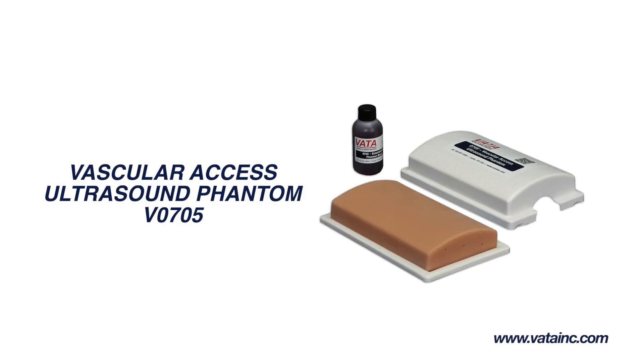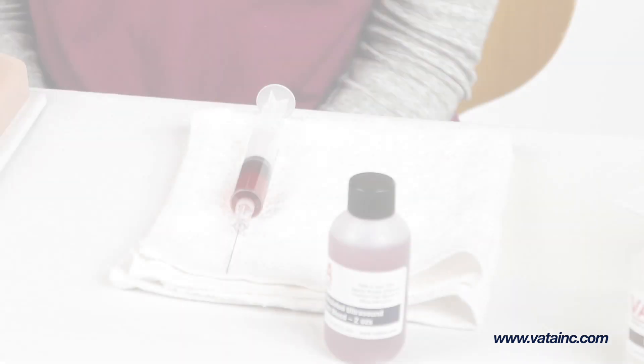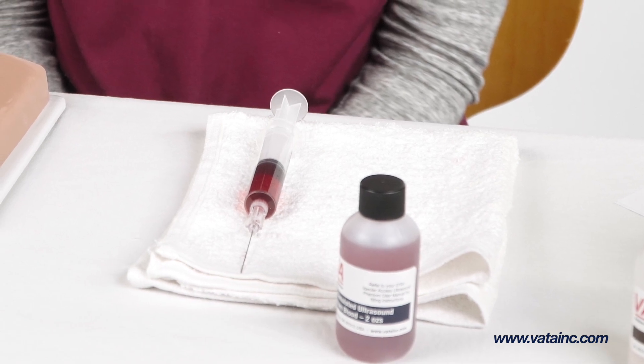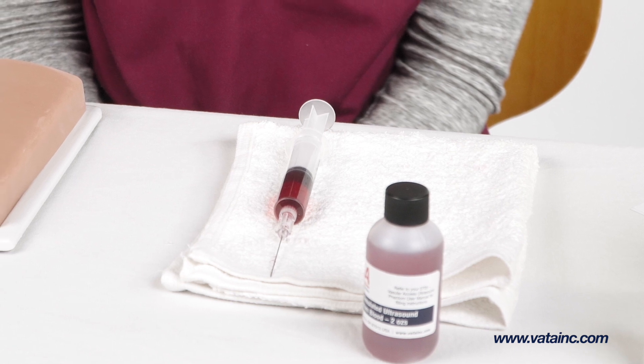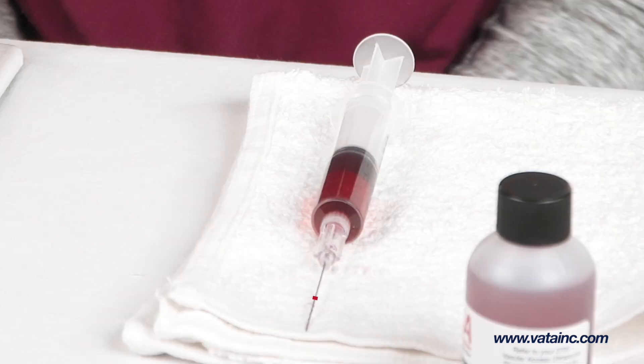With normal use, you may find a reduction in the amount of fluid in the vessels and/or that air has been introduced. This is normal and can be corrected in the following manner: pre-fill your syringe with simulated blood and expel any air left in the syringe, then leave half the syringe volume unused.